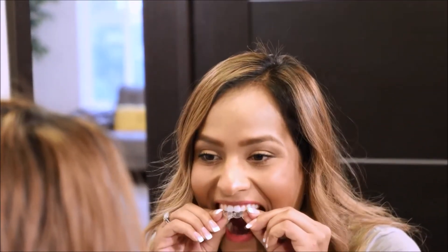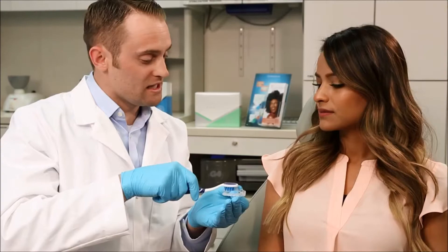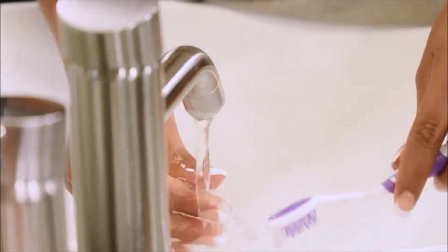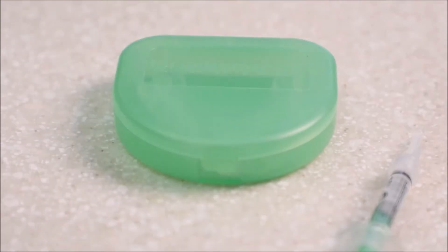After the recommended time is over, remove the tray from your mouth and brush your teeth to remove all the gel from your teeth. Clean the tray with a soft toothbrush and water. Store trays in the case provided by your dental office.